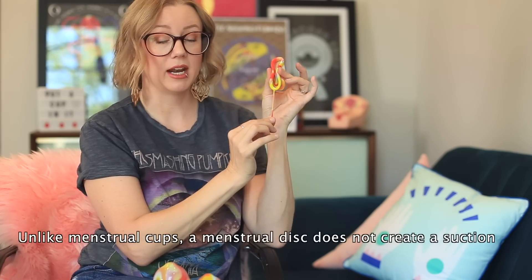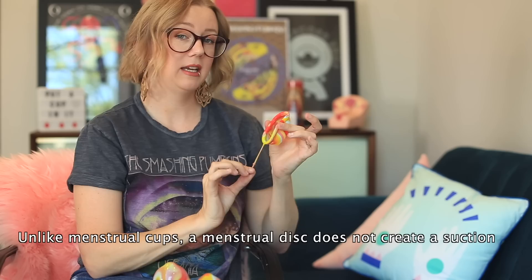The Luma Unique also has a string. This string can be useful — I left it on for the first two days that I tried this disc. It takes away some of the negatives of removing a disc. Generally you would hook this part that's inside and pull it down, but I generally can't do that successfully, so I have to reach in and grab it. Having the string meant I could pull it downward without getting super messy, empty the bulk of it while it's hanging out before fully removing it — making the process a lot less messy.